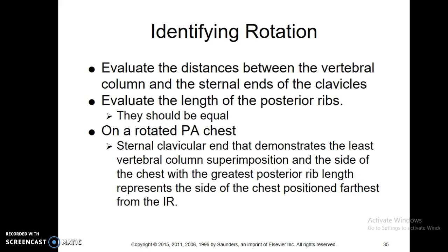Projection — rotated PA chest, as we talked about before. Just look at the vertebral column and then look at the clavicles and make sure they're equal distance away from the spinous process.